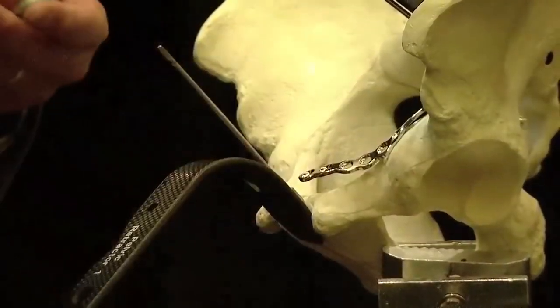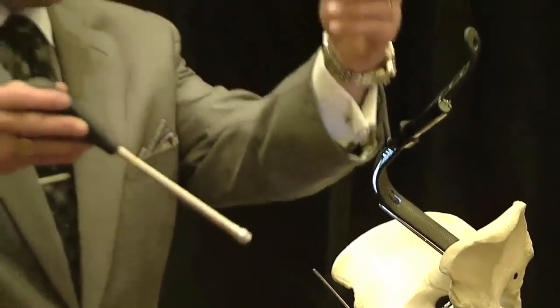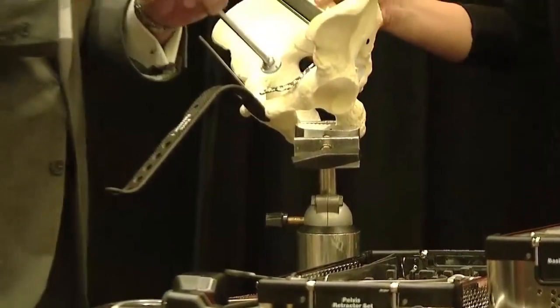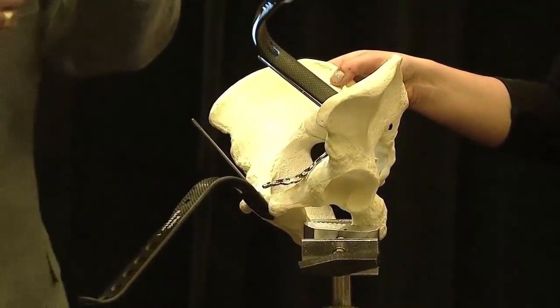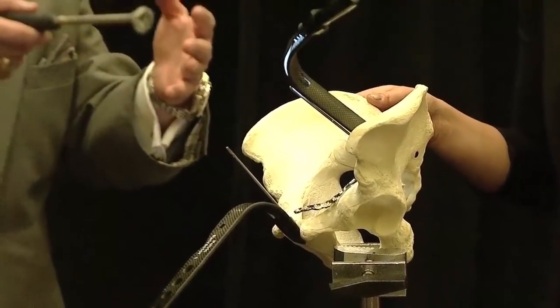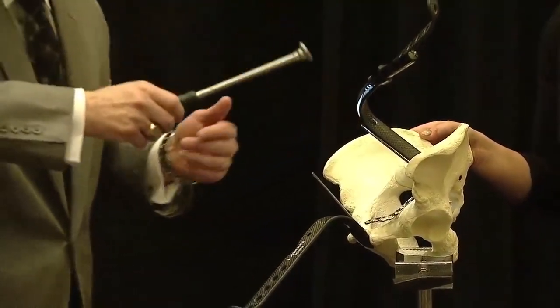The one thing I didn't show you is the spike screw inserter has a large washer on it as well that can be used to give you more surface area. As Claude alluded to, sometimes you need more space because of the bone. And this one has some holes in it that once you get it in place, you could then pin it through the washer as a provisional holding device, more or less like a small plate. And you can work through it, you can put a screw through it if you need to.